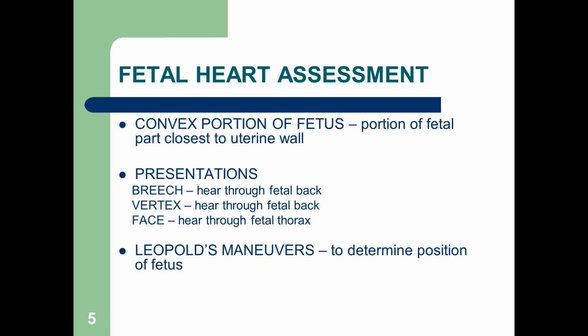So let's look at the fetal heart assessment. When you hear fetal heart tones, that confirms fetal position, and knowing the fetal position will help you locate the fetal heart tone. That sounds a little confusing, but oftentimes we gently palpate the abdomen so we can almost feel body parts, and it will help you to know the best place to position your Doppler for monitoring fetal heart tones, okay?